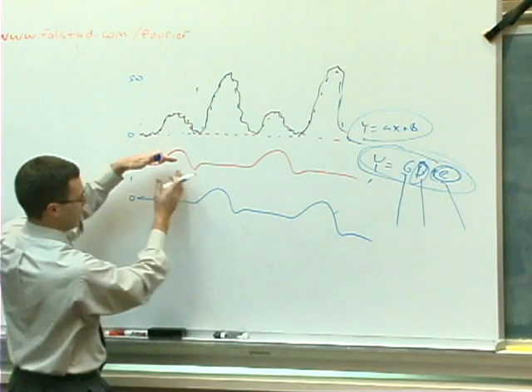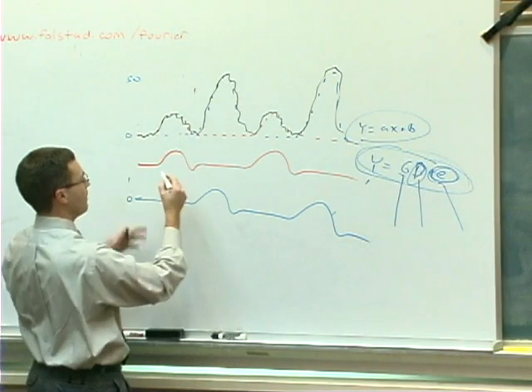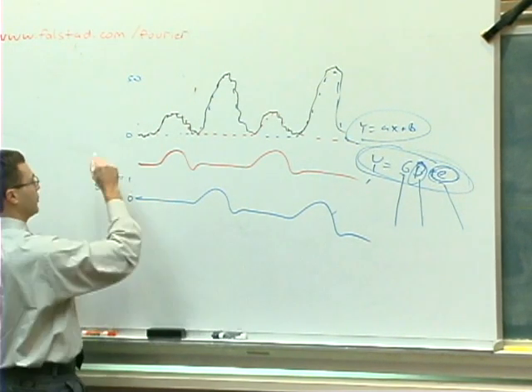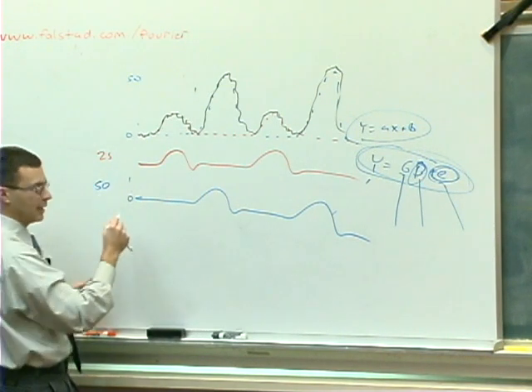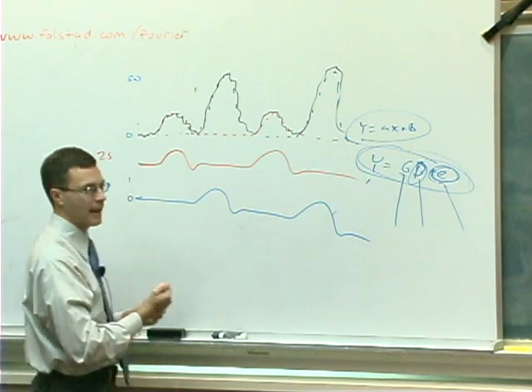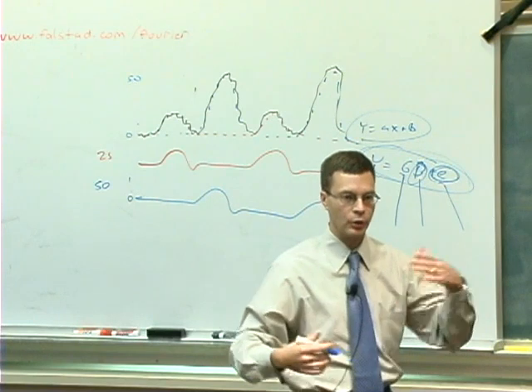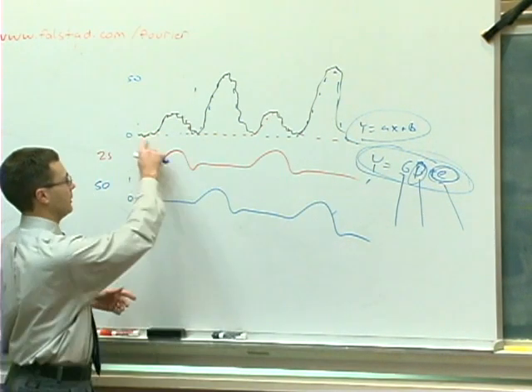So this thing needs to be stretched out 25 units. This needs to be stretched out 50 units. So the beta value on this is going to be 50. The beta value on this one is going to be 25. Okay? So a bigger beta value here indicates a larger effect. Does that follow? Okay, so the beta value is the magnitude of the effect. It's answering the question, how big was the difference between your condition and the other unmodeled baseline, this sort of baseline state.